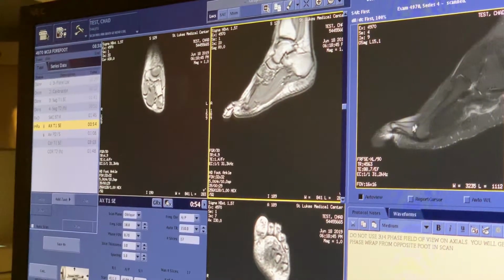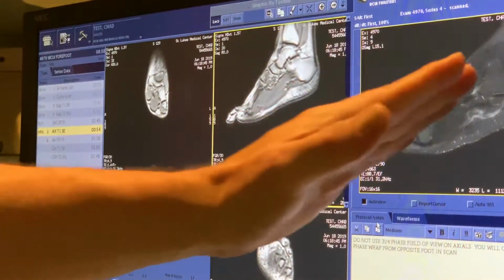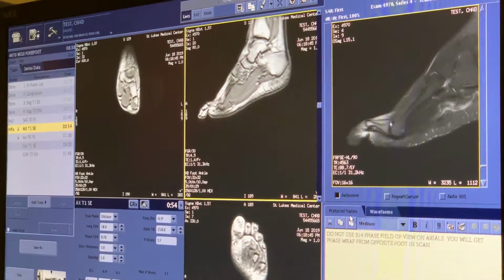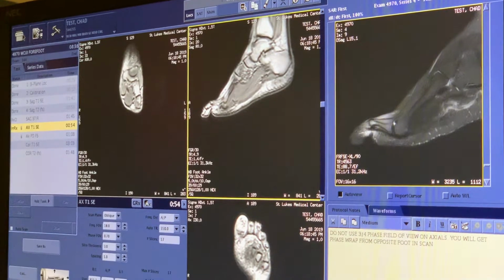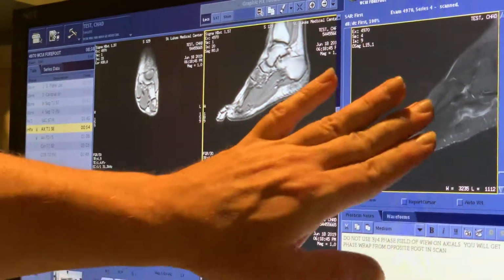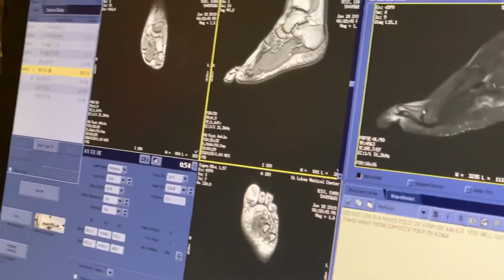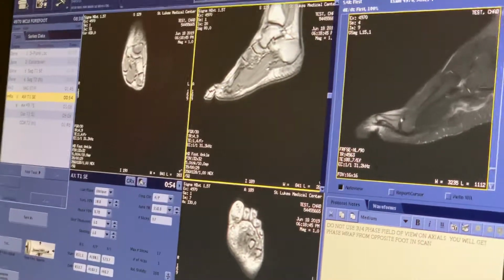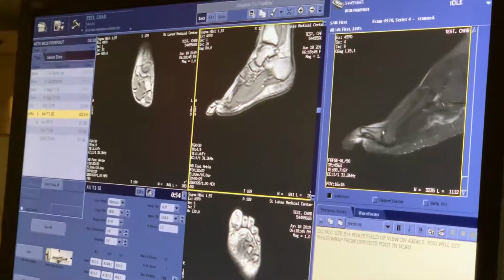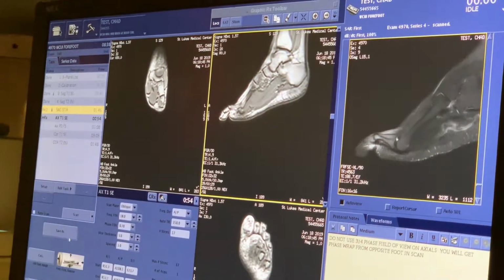So this is not ideal. This happens because of what's called the magic angle artifact, where you get this certain angle that causes this to happen. And a lot of people's toes have that angle. You can try to do things. I've seen people put like sandbags in here. I've seen people try to put small bags of saline in there to try to fix the problem. Sometimes it helps, sometimes it doesn't. But if you feel like, you know, playing around, you can try it. It might improve the situation. Let's run this one. Okay, this next scan is 2 minutes long.